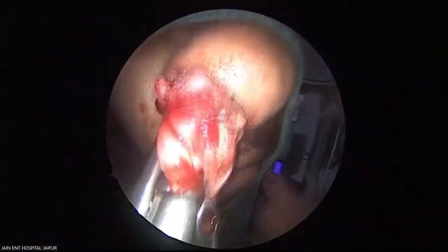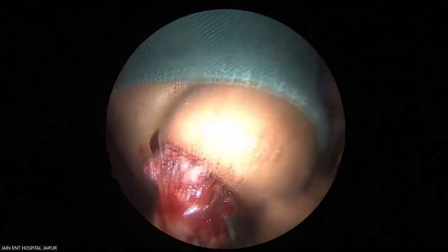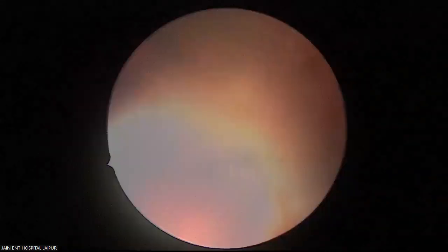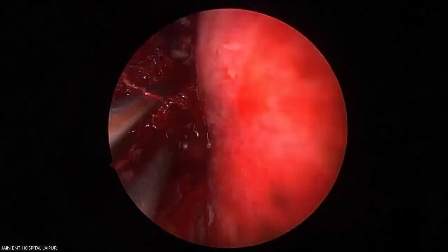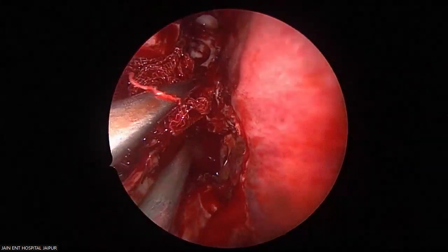See this? Oh my God, beautifully. Big one. Big lateral component. Dumbbell shaped. Still we have some of the tumor remaining in the pterygoid and in the orbital fissure.